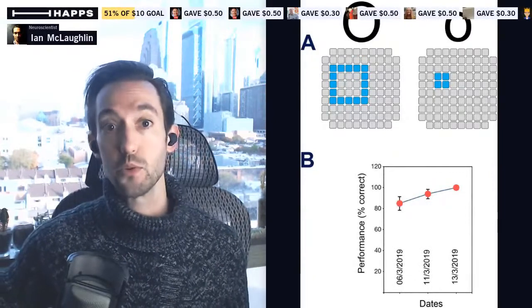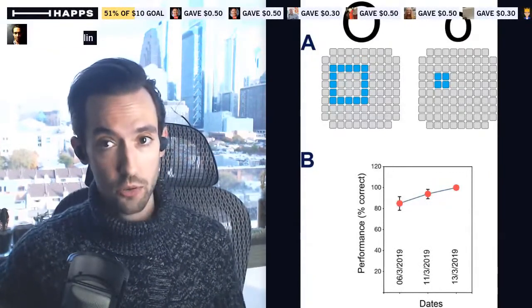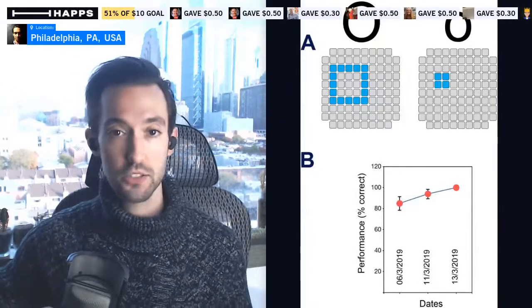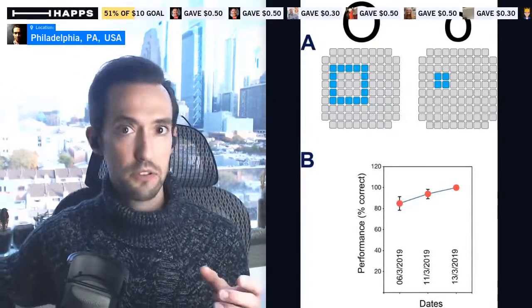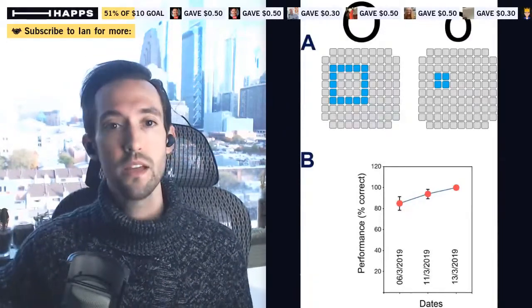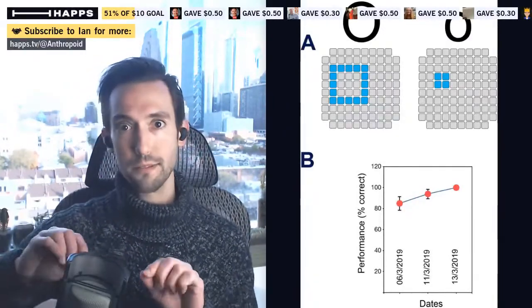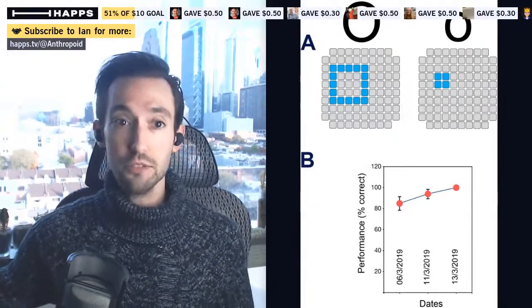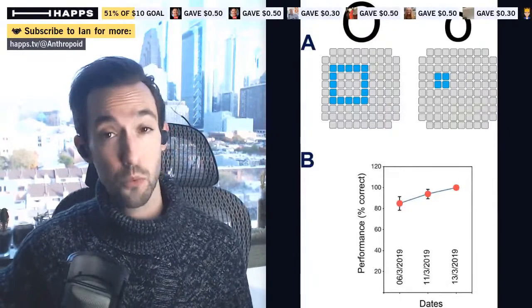And so you're seeing the difference between a capital O and a lowercase o. And as you can see, over time, Bernadetta grew to get better and better at discriminating that subtle difference. I mean, obviously, these are different characters, but a capital O and a lowercase o, that's pretty subtle. We're talking about like millimeters of a difference in what those characters look like. And she reached 100% accuracy after just a week.